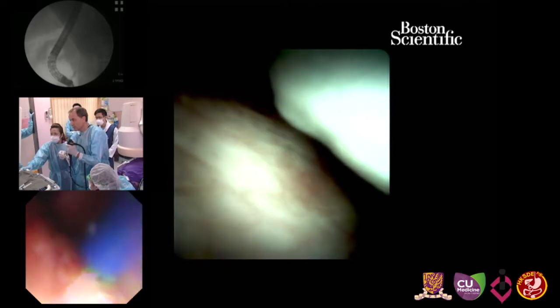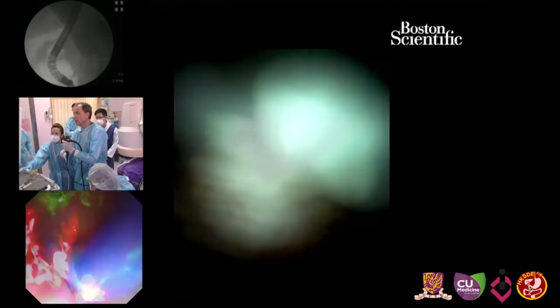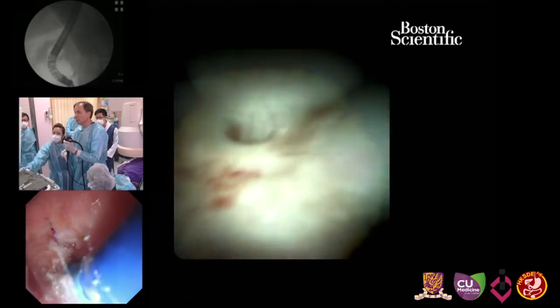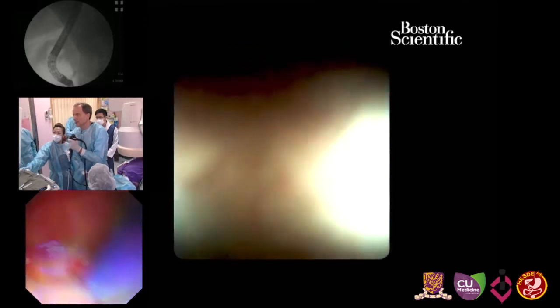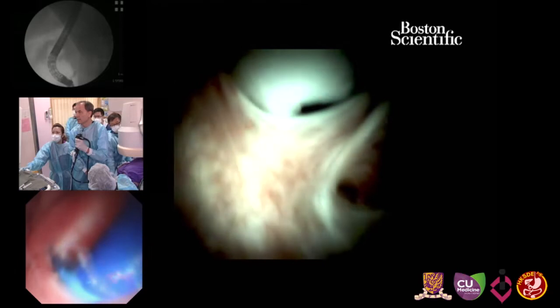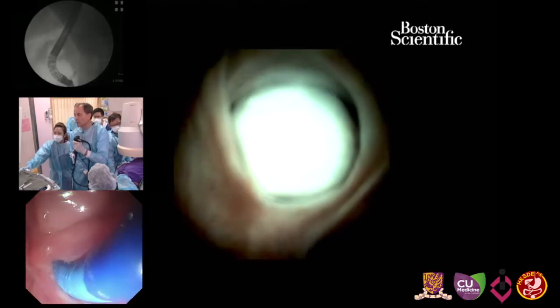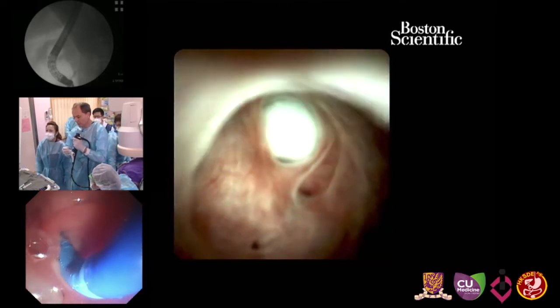So I pull this spy slowly back and I advance the scope more deeply into the main pancreatic duct. We can nicely see also the side branches, the vessels. So we didn't cause any trauma here. Some stones in the side branches. Here is still a larger one. We are in the main duct, stop this flushing. You can see I can manipulate and can even approach side branches. So I advance.